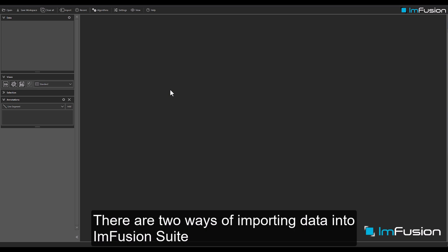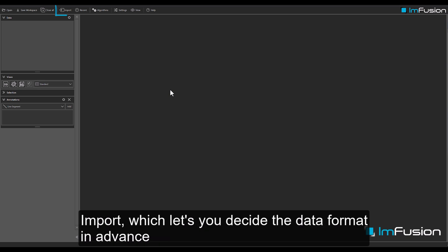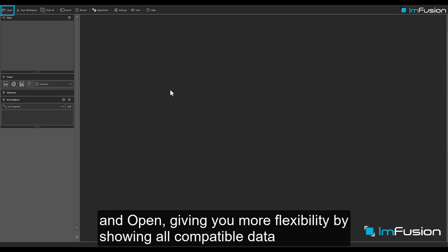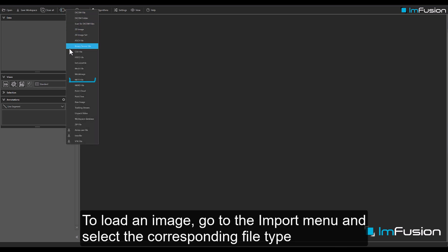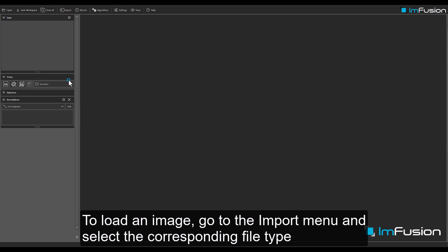There are two ways of importing data into Infusion Suite: Import, which lets you decide the data format in advance, and Open, giving you more flexibility by showing all compatible data. To load an image, go to the import menu and select the corresponding file type.